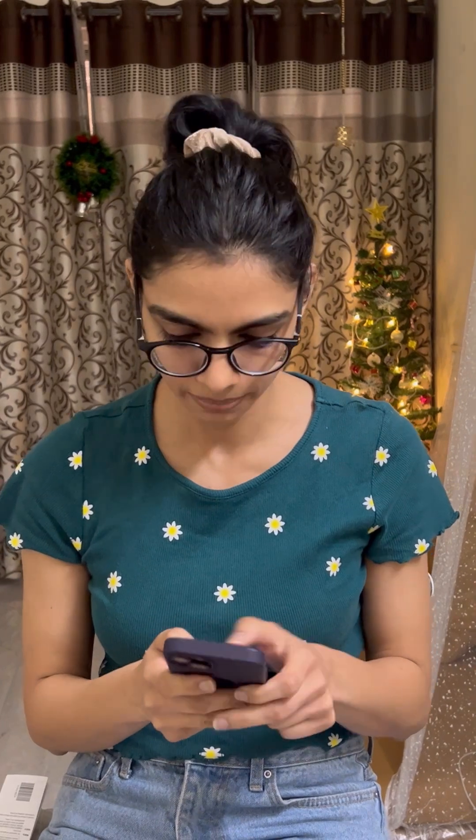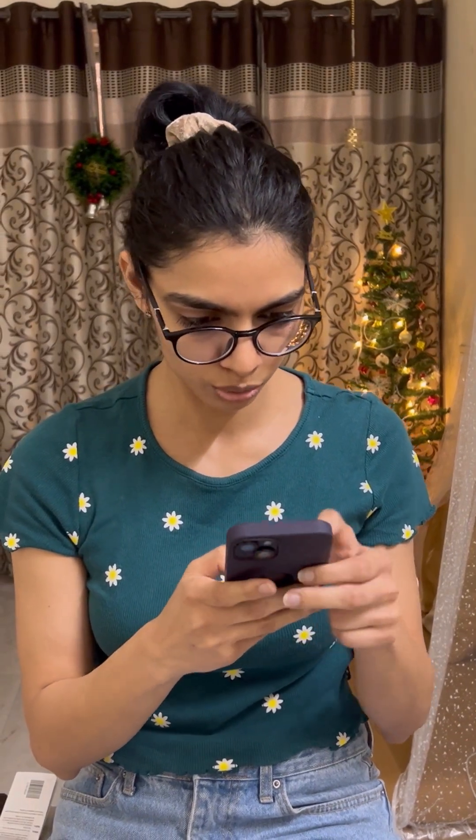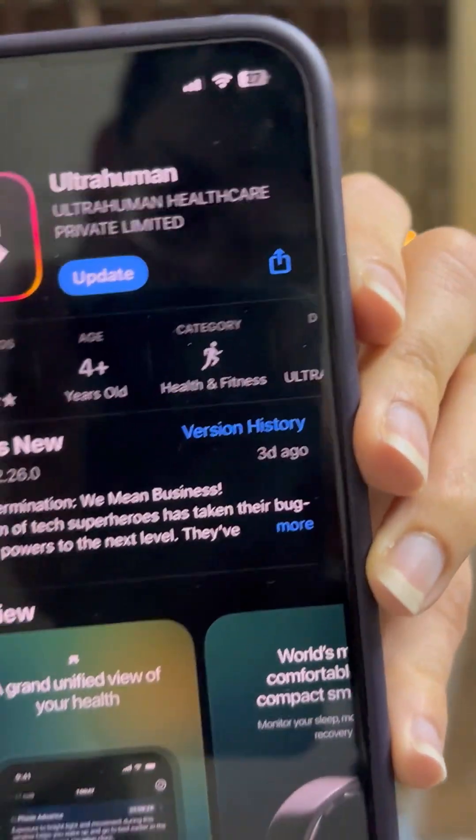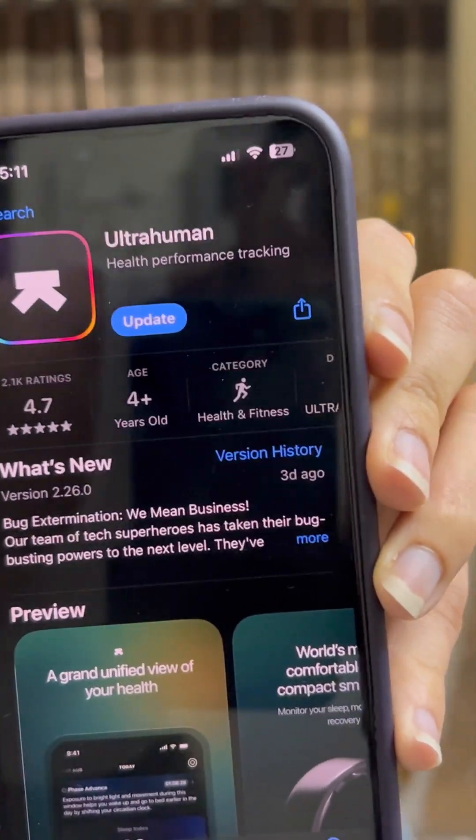To activate this sensor, we'll be using the Ultrahuman app. You can go to the App Store or Play Store and search for the Ultrahuman app. Make sure that your phone is NFC enabled. If it's not, you can go into settings and turn on NFC. If you have an iOS device, NFC is automatically on.